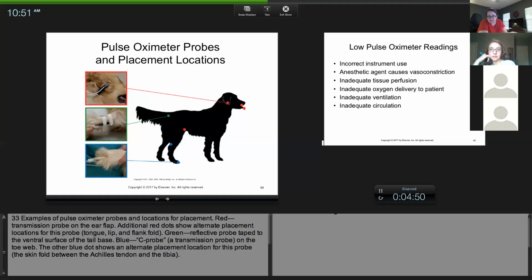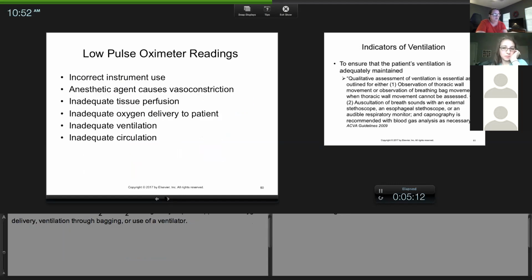I'm going to want to clean it really well, because I usually just take alcohol wipes, clean it, and then it's ready for the next patient. You can use alcohol to clean, but you don't want to use alcohol to clean a Doppler. You have to be careful because that's a sensitive crystal. The light sensor, you can wipe off with alcohol, because there's nothing worse than going to grab a probe and it's yucky.